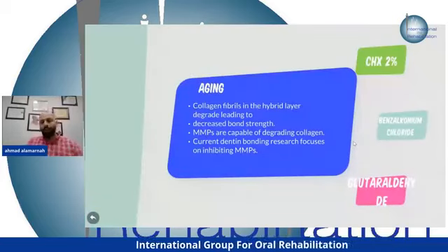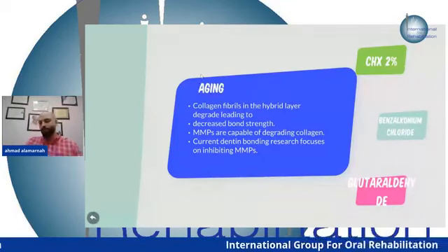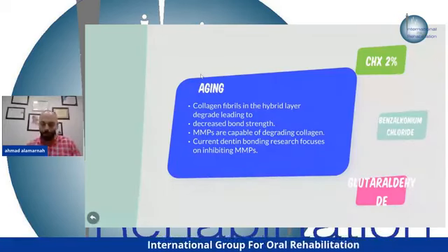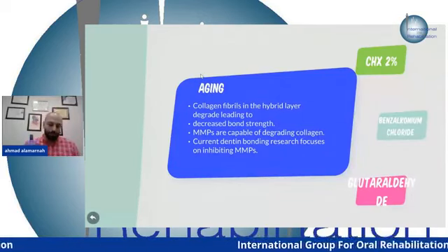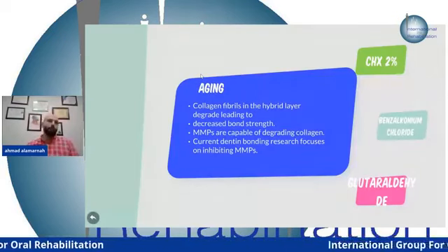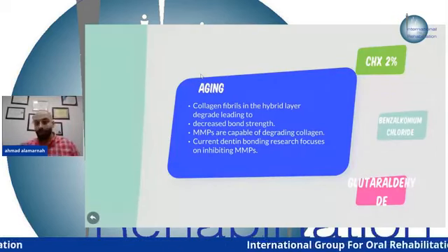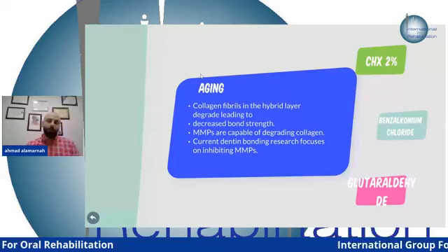So after doing etching, here I said aging. What's the meaning of aging? Aging comes after the bonding, but I use this term here because the procedure to prevent the aging is after the etching, but also before the bonding. So what's the aging? There's something called matrix metalloproteinase enzyme. This enzyme is normally produced by the tooth from the dentin as a response to the acidic attack from the caries, from the food if there's an exposed dentin, or from the procedure that we're using, the acid etching.